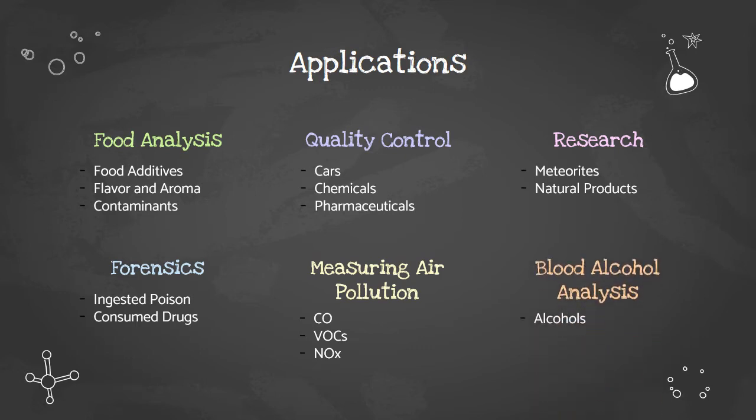Blood alcohol analysis. Gas chromatography has been used since the 1950s to detect blood alcohol levels. Since then, it has continued to be used to detect how much alcohol a person has consumed, to help gauge how impaired their normal functioning may be.